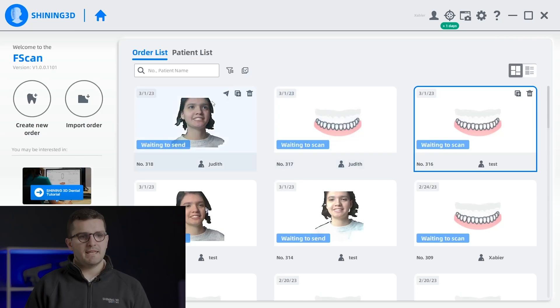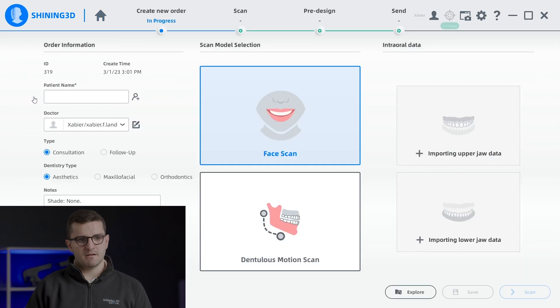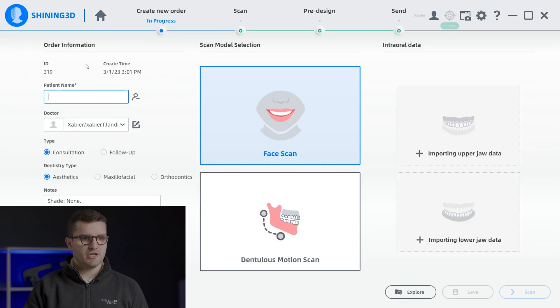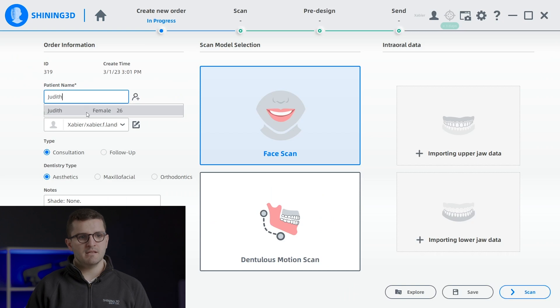Today, we have the pleasure of having Judith as our patient. To get started, we'll need to record her information in our software. By adding basic details such as her name, age, and gender, a new patient can be created in a matter of seconds.